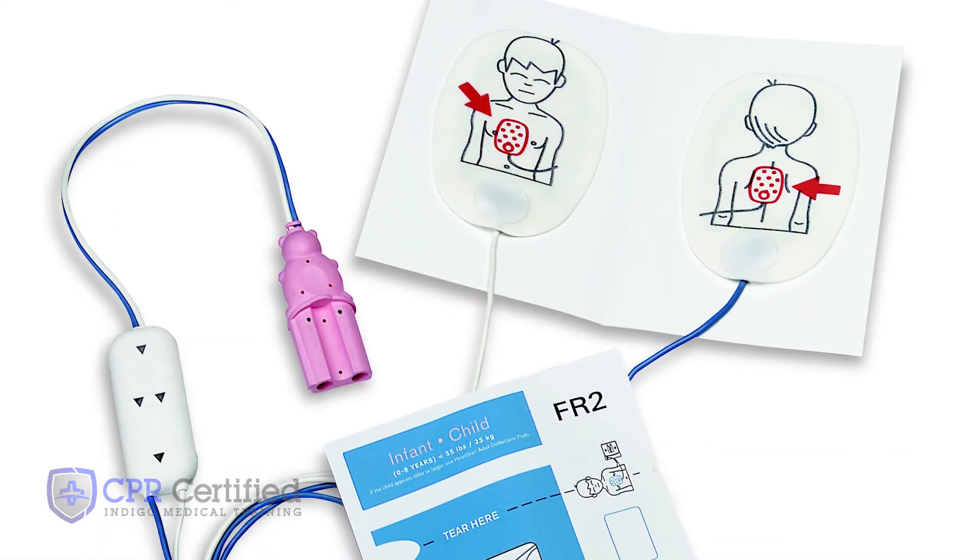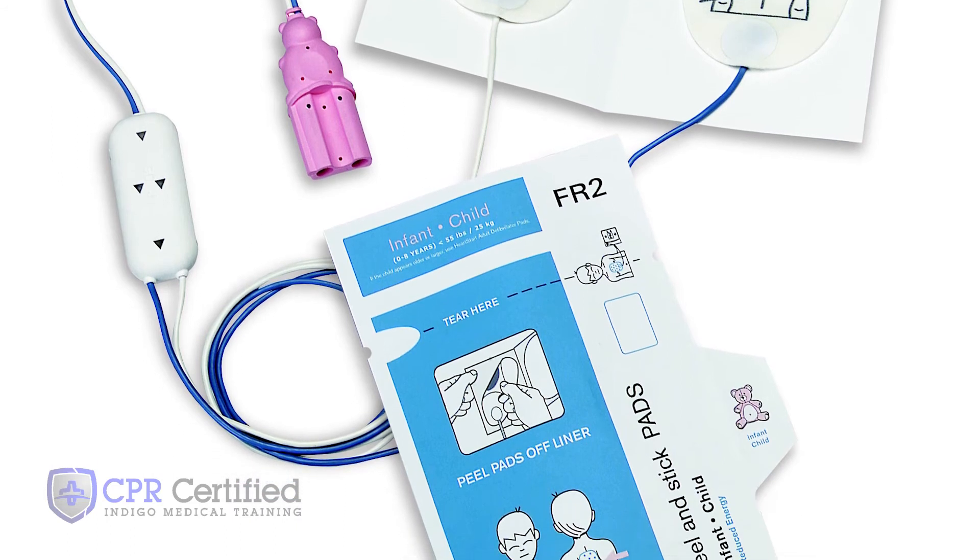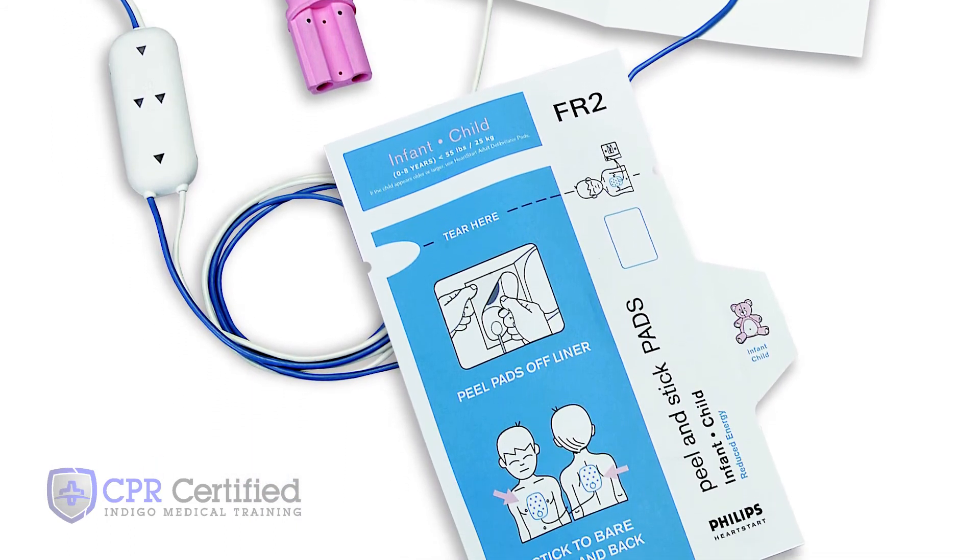If the AED kit has pediatric pads, use them for the child victim. The pads are smaller, and the pad placement is the same as for adults. Just follow the diagram on the pads.